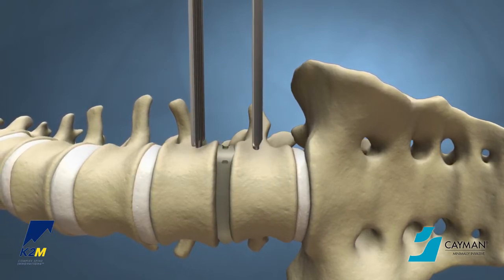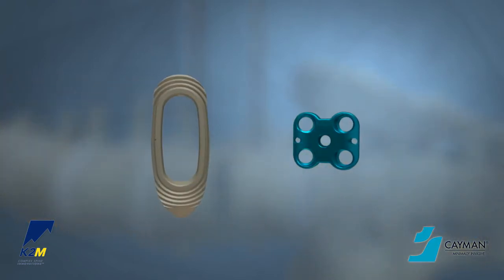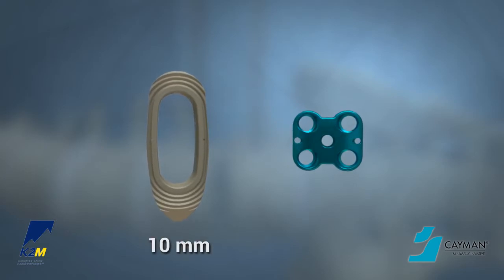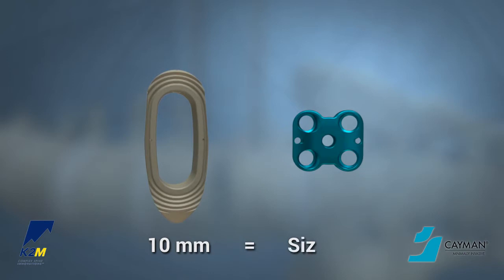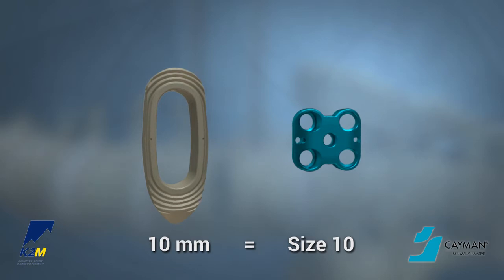This will ensure a flush seating of the plate to the vertebral body. The Cayman MI plate sizes correspond with the elution lateral interbodies. For example, when inserting a 10 mm height elution lateral interbody, a size 10 Cayman MI plate may be used. If a larger plate is preferred, a larger size such as a size 12 or 14 can be used.